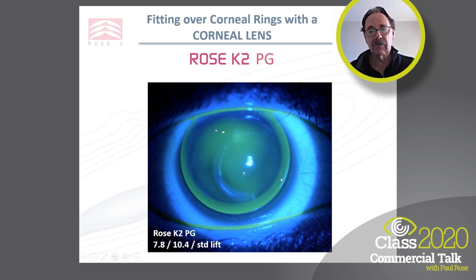We have a lovely edge lift here. Is that flat? Pretty hard to judge, but it looks like there is fluorescence here. You don't want to see bearing over that area, otherwise you'll get staining. But overall, that's an excellent fit over that single ring.